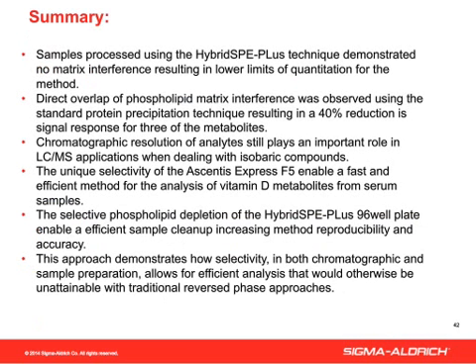So with that, I'd just like to go just in a bit of a summary then with the hybrid SPE plate. It does demonstrate the ability to deplete phospholipids, resulting in no matrix interference and better limits of detection and quantitation using the sample prep method. It also adds to time savings too, because as Mike showed, we can simplify the sample prep a bit and actually speed up the assay by not having to do tandem or two-dimensional LC for the sample preparation.